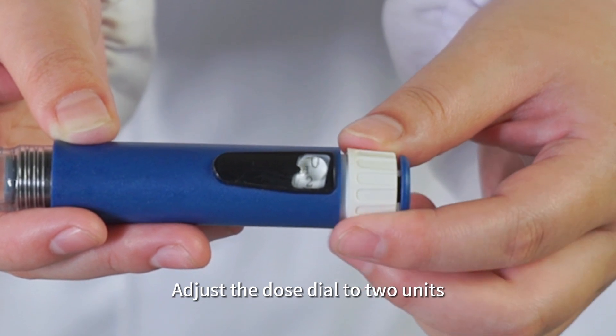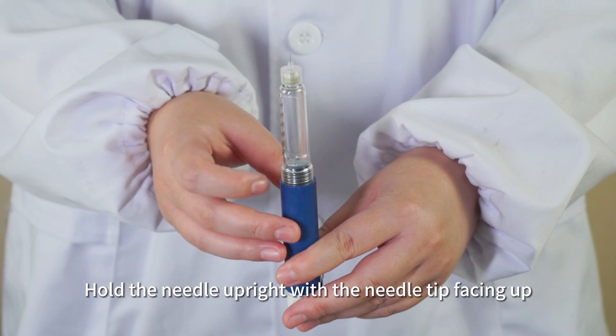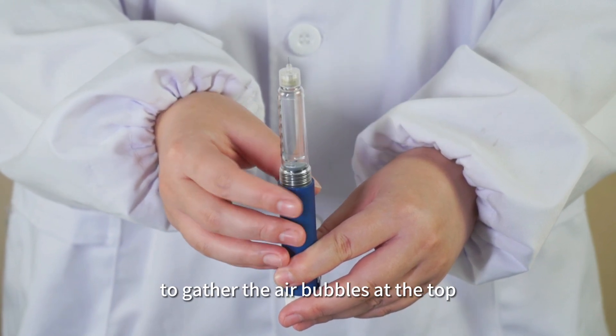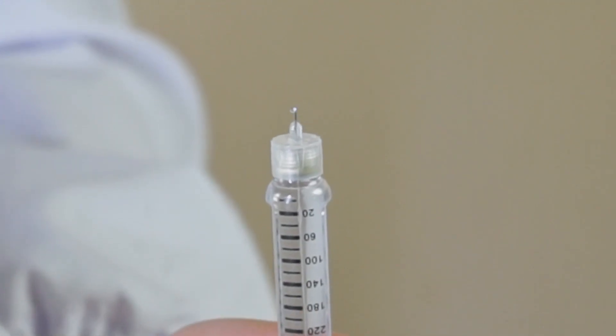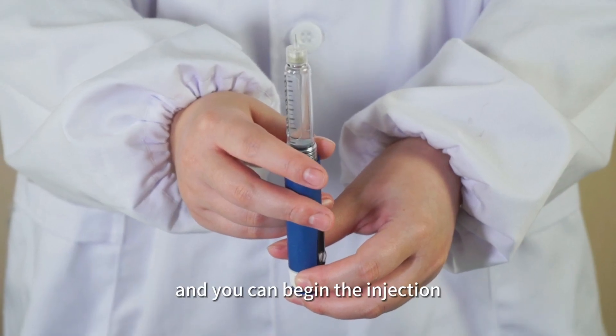Adjust the dose dial to 2 units. Hold the needle upright with the needle tip facing up. Gently tap the pen tip with your finger to gather the air bubbles at the top. Push the injection button until you see a stream of insulin coming out, indicating that the air has been expelled and you can begin the injection.